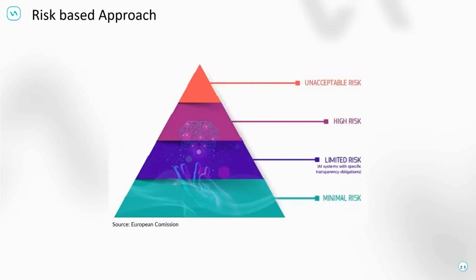So, going into the classification, which is one of the main things, that talks about minimal risk, limited risk, high risk, and unacceptable risk. Unacceptable risks are products which are totally banned from the market, where the European Union says no, that's not allowed. High risk products are products on a certain annex, on a certain table, and those are the ones which can be part of medical devices. They can be safety critical devices. There can be a lot of additional products which can be there.